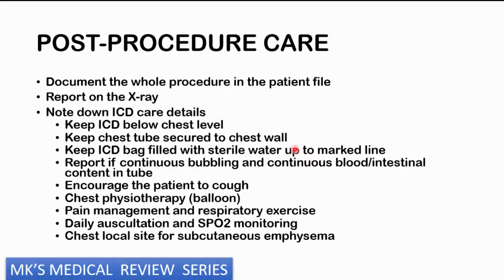And of course, there should be some ICD care details that are taught to the patient, or instructions that are put in your plan. So remember that you should always keep the ICD below the chest level. The chest tube should be secured to the chest wall with your suture. And then, of course, the ICD bag must be filled with sterile water up to the marked line. If you insert this ICD, you should report if there is any continuous bubbling or continuous blood or intestinal content that is present in the tube.